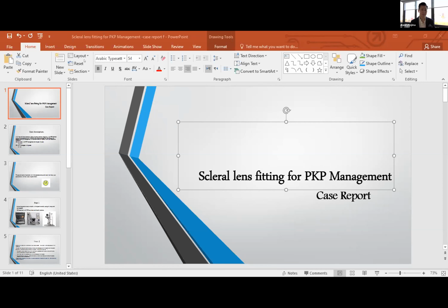But with a scleral lens, we can put fluorescein underneath the lens and then send the patient away for 8 hours, and they have the same apparent volume of fluorescein behind the lens after 8 hours of wear. So it appears that with this huge volume of fluid, maybe that's the difference, that there's so much fluid behind the lens. If it were thinner and not exchanging, it might be more of a problem with metabolic waste buildup, but possibly because it's so thick, it's less of a concern.